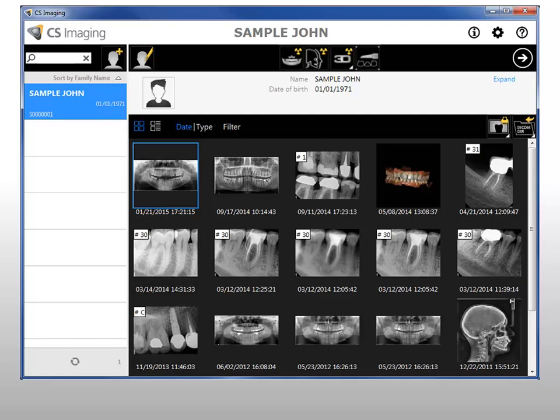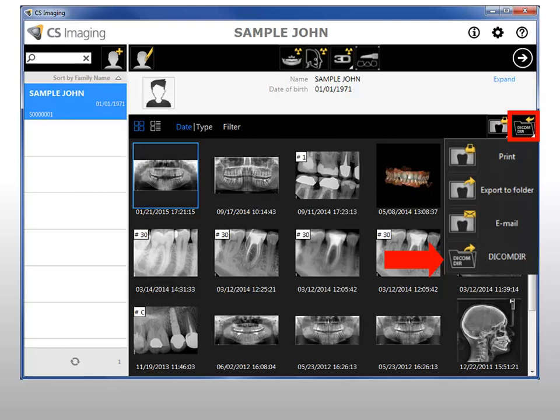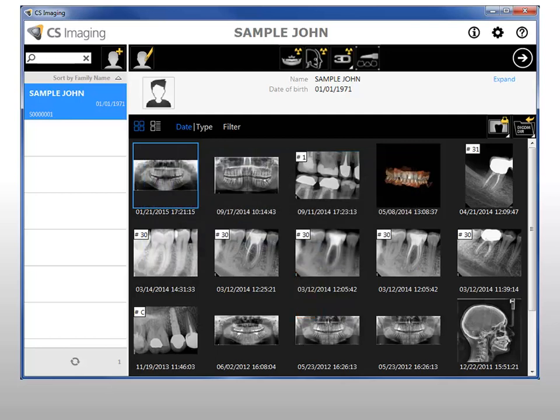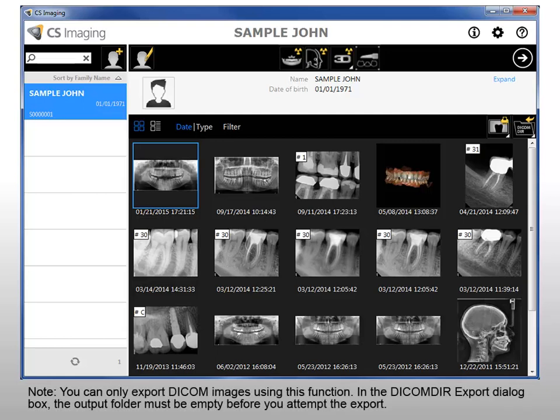To export images as a DICOM DIR file, in the Patient History, select the images to export. In the Image Management Tools, click DICOM DIR Export. The DICOM DIR Export dialog box is displayed. Select your export options and click Export. The selected images and files are exported. Note, you can only export DICOM images using this function, and the output folder must be empty before you attempt the export.